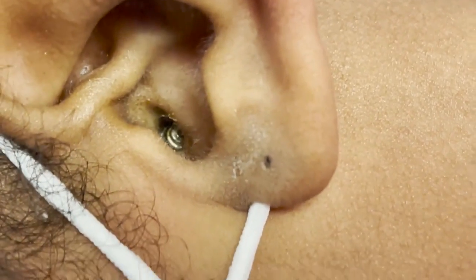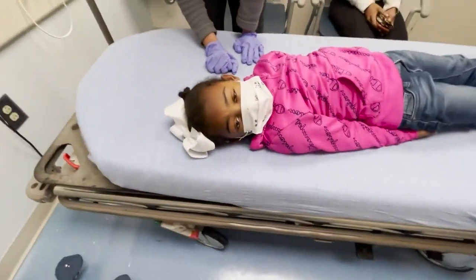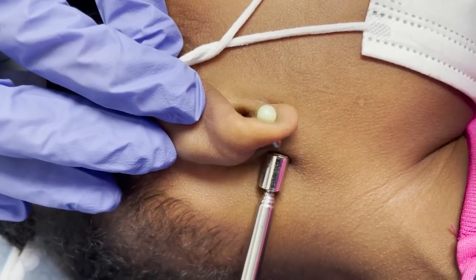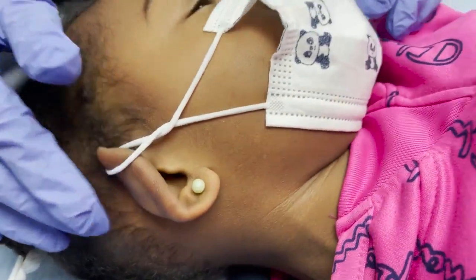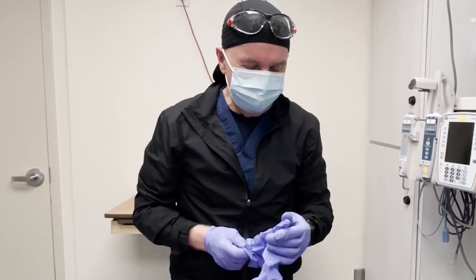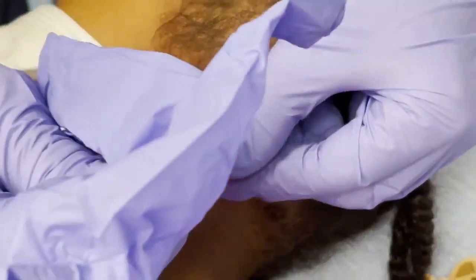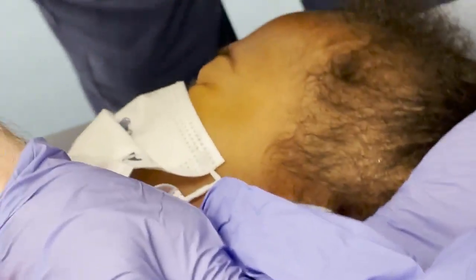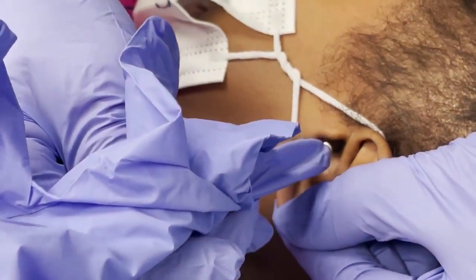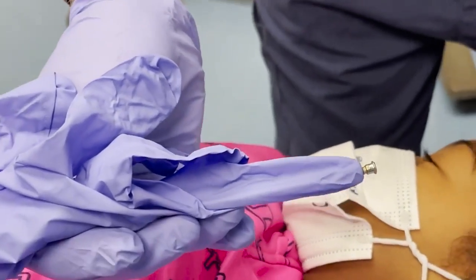Right there is part of her earring. What we're trying to figure out is whether or not this magnet's going to work. It's going to work. What I'm going to do is just put this in a glove here. So now we're going to go ahead. I heard a click. There it is. Success.